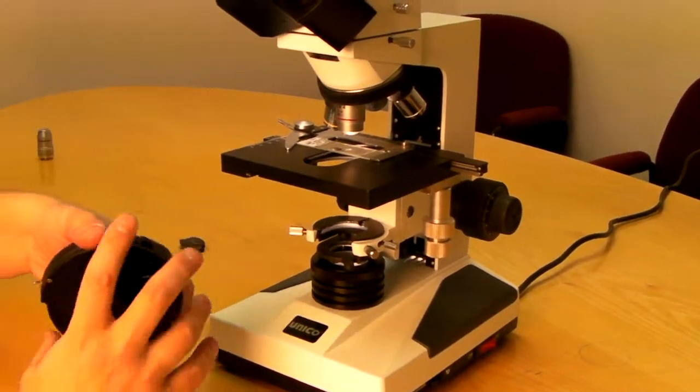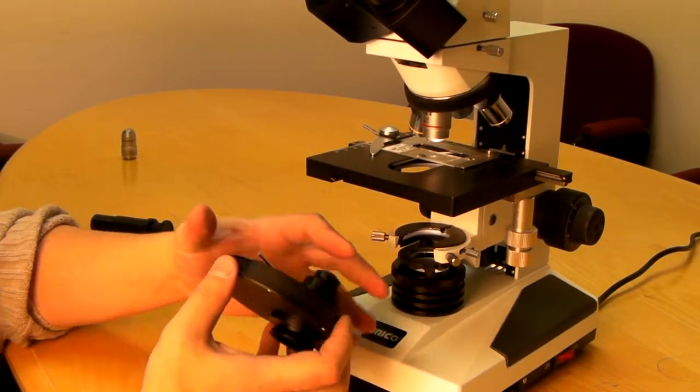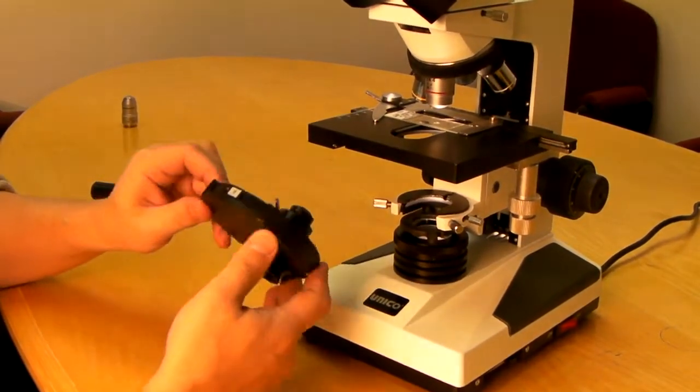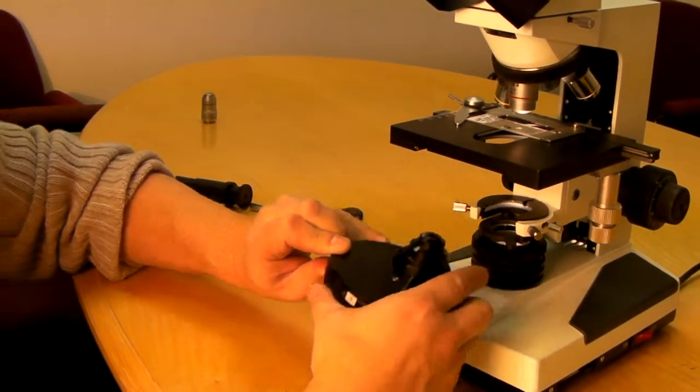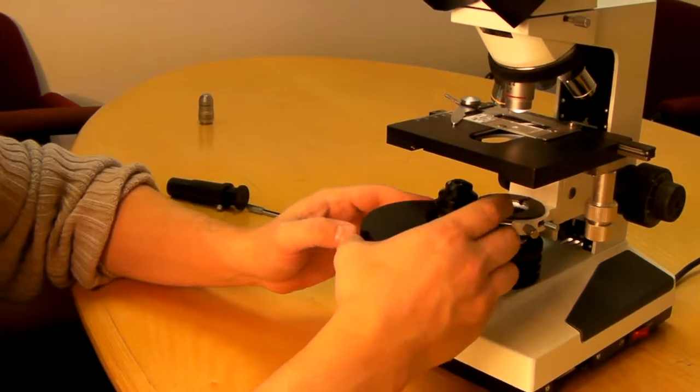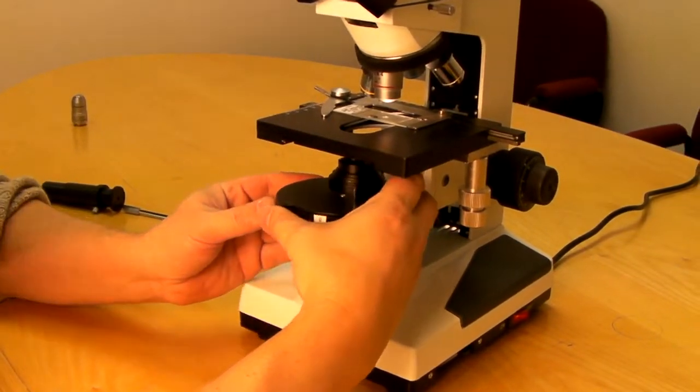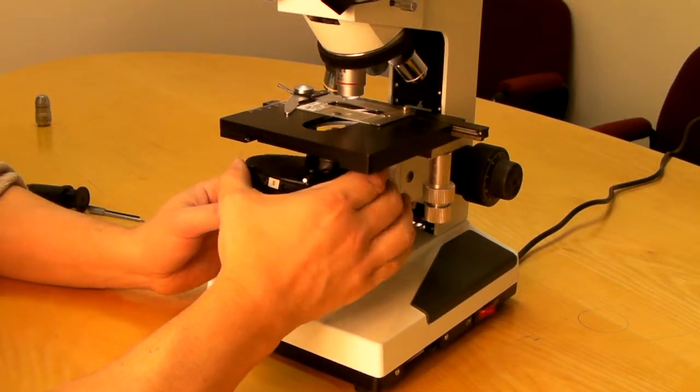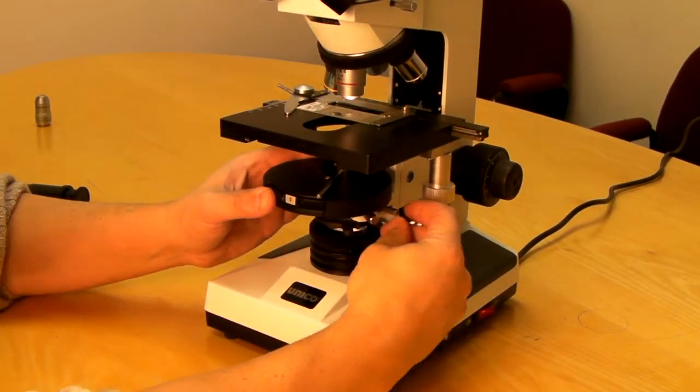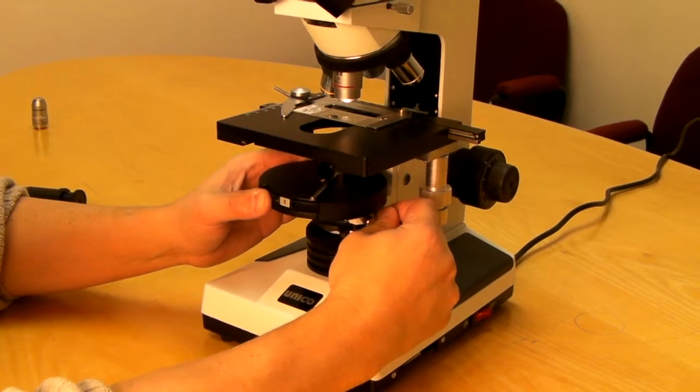Take your phase condenser. Your phase condenser has the guiding screw right here. Make sure it matches the groove. Carefully position it and secure with the same screw.